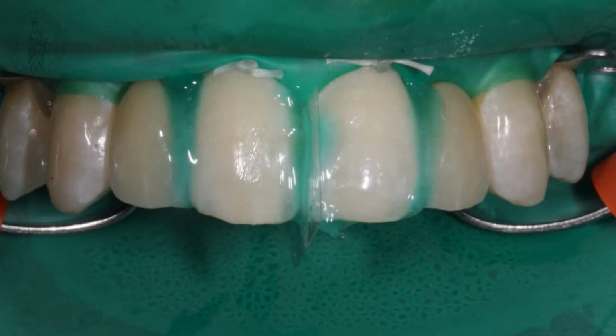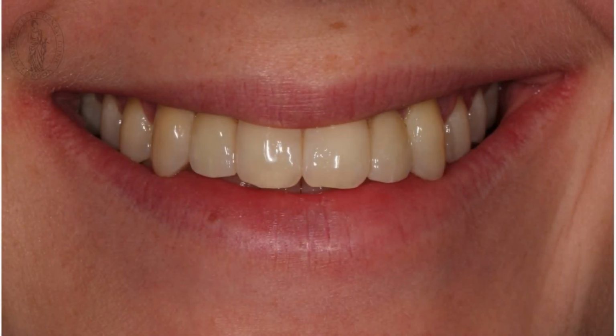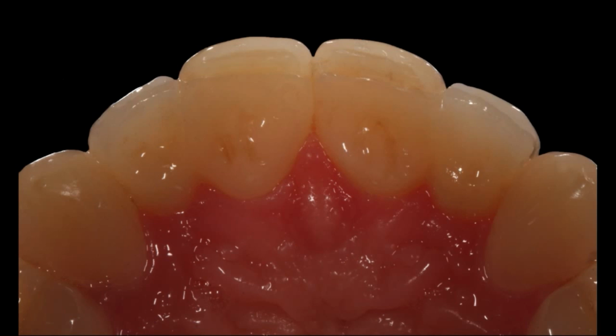And that's about to look perfect. The bonding technique is a little bit technique sensitive, so you have to do it really in the proper way. And if you do that, you have a success rate of approximately 80% over 20 years, which is comparable to conventional bridges and or implants. And you can see here the final situation. The bridge blends in perfectly to natural teeth and the normal situation. So it's a great achievement in this case, and you can see no color problems anymore. You can see the picture from behind, so that looks absolutely perfect. Very pleased with the result.